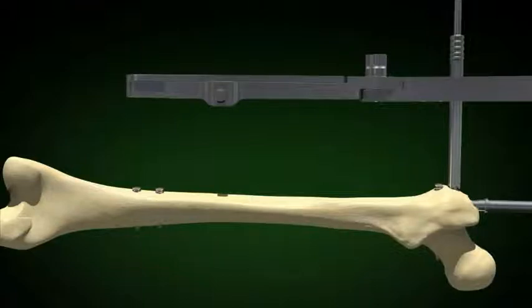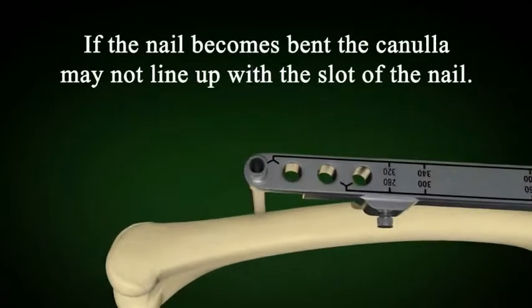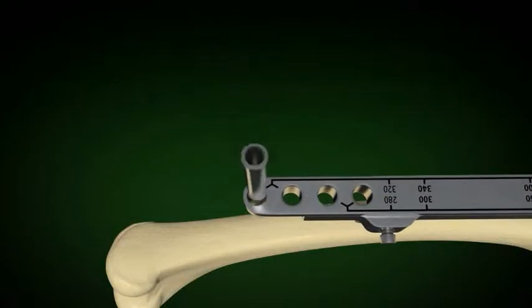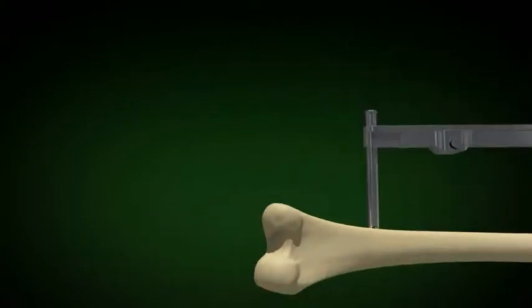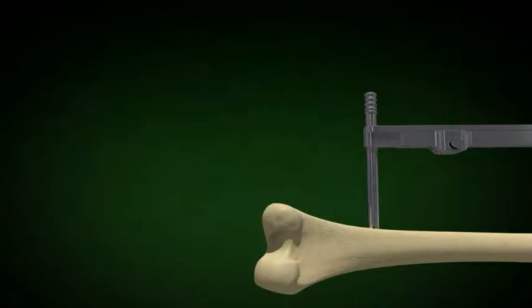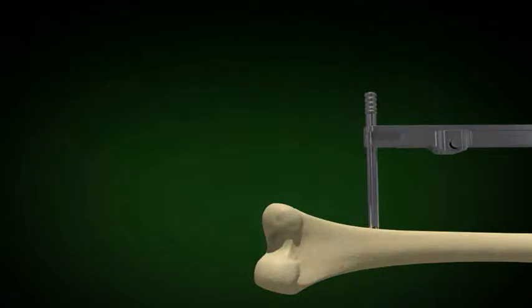If the nail becomes bent, the cannula may not line up on the bone. Adjust the target arm so the cannula rests on the bone. Remove the cannula, loosen the adjustment screw, and align the target arm so the cannula rests on the bone. Use the small drill guide and drill a hole in the near cortex. Use the large drill guide to enlarge the hole with the step drill.